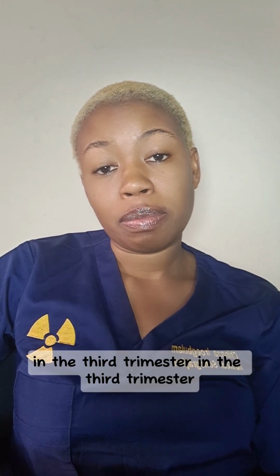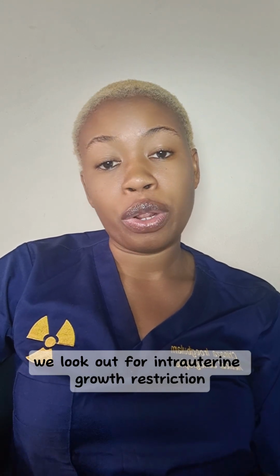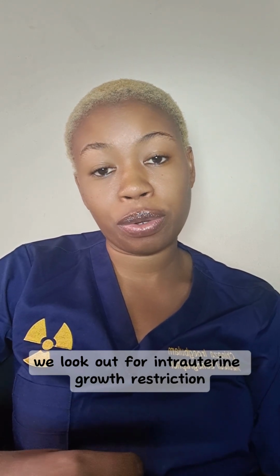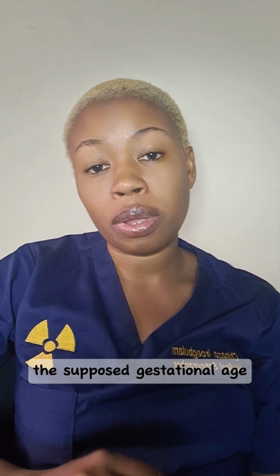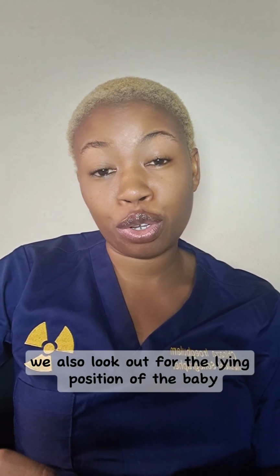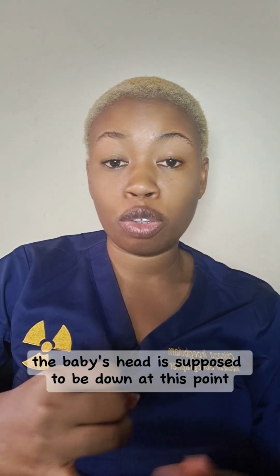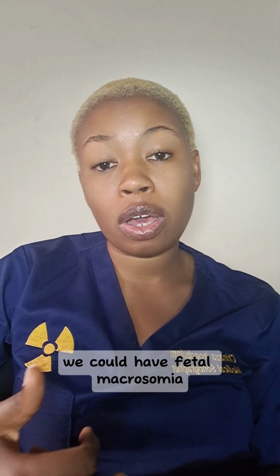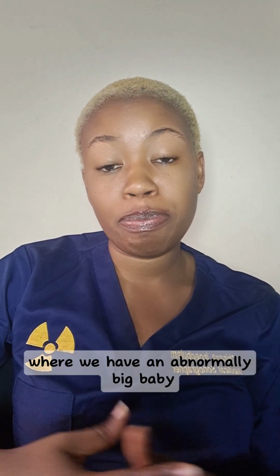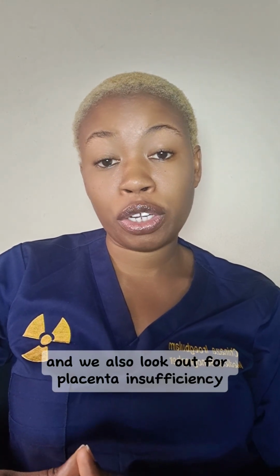In the third trimester, we look out for the growth of the baby. We look out for intrauterine growth restriction, where the baby is smaller than the supposed gestational age. We also look out for the lie position of the baby. At this stage, we are checking if the baby's head is down. The baby's head is supposed to be down at this point. We are also looking out for the fetal weight. We could have fetal macrosomia, where we have an abnormally big baby, bigger than it's supposed to be while still in the womb. And we also look out for placenta insufficiency.